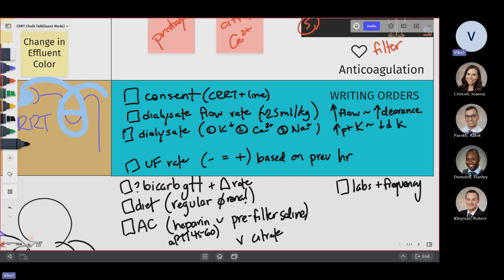We usually give the nurses a broad range. We'll say, okay, start the patient for a fluid removal, let's say 25, and gradually up it up to 75 or 100 cc, however comfortable you are. So in that way, the nurses usually have time and they have their own comfort space and they can play around with the fluid removal gradually on these patients.